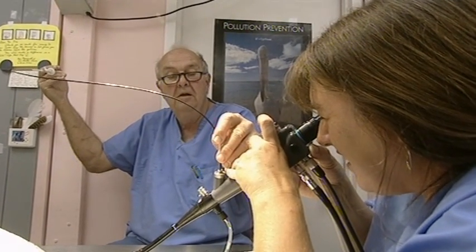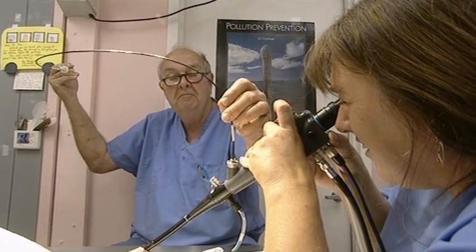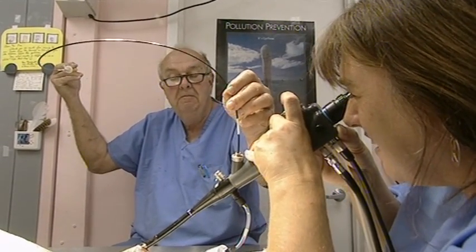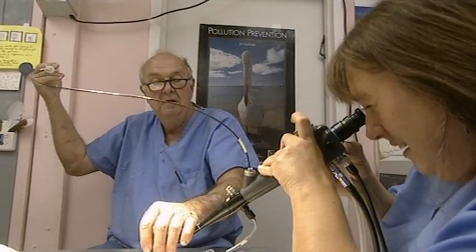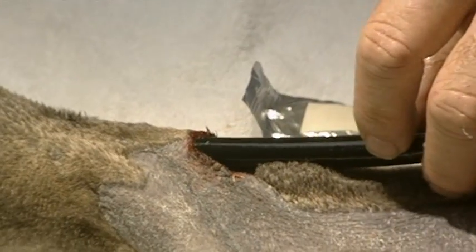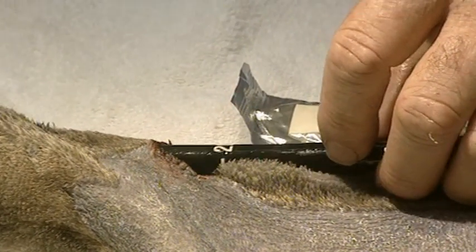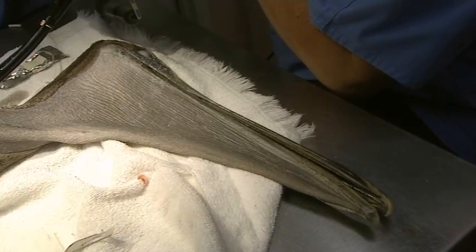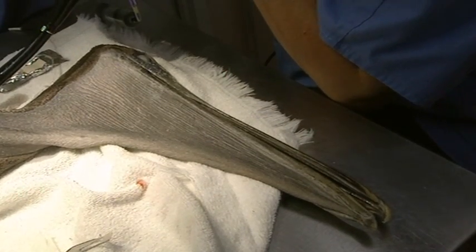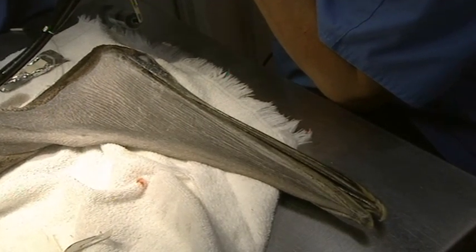Have you got any resistance on it? I got something. Let's try. Is something following you out? I can't see it. I can't see anything. It's like ice fishing. Nothing. All right, let's go down again. I definitely saw the hook. Let's go down again. The hook is in the pelican's stomach, but it won't budge.